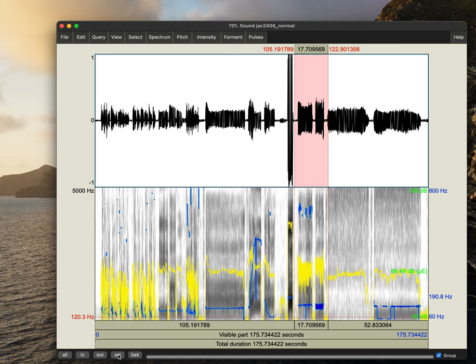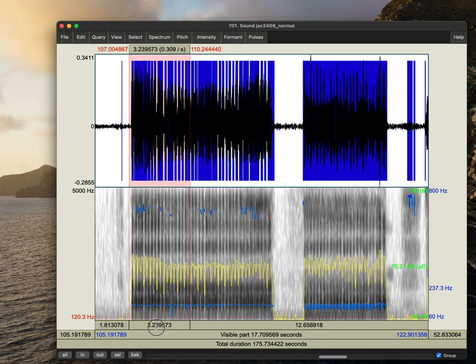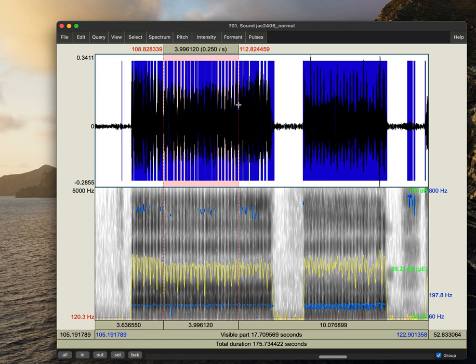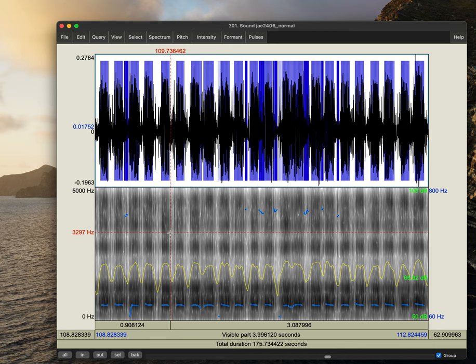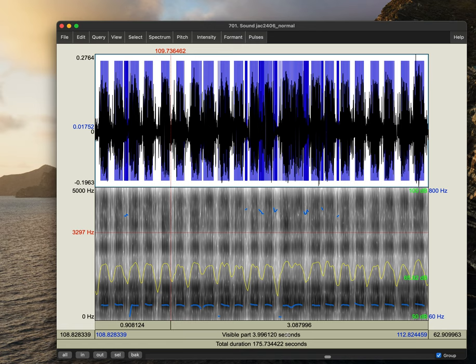And then if we wanted to look at laryngeal DDKs, we would zoom in on our laryngeal DDKs. Okay. So this is the first of those two laryngeal DDK tasks. I'll zoom in a little bit. Actually, I'll look at the middle three seconds or so. And we see that that was four seconds. So that's fine. I'll select this. And here we can count our waveforms or we could look at the intensity contours or the pitches to look at, to count the number of repetitions that we're seeing and then divide that by the entire visible portion that we just outlined.